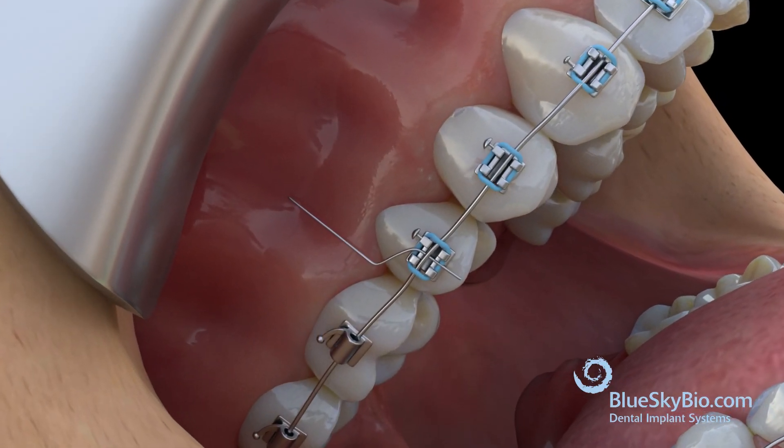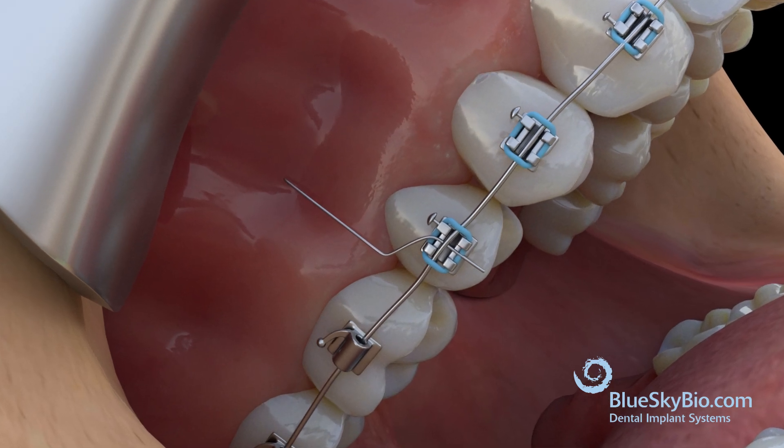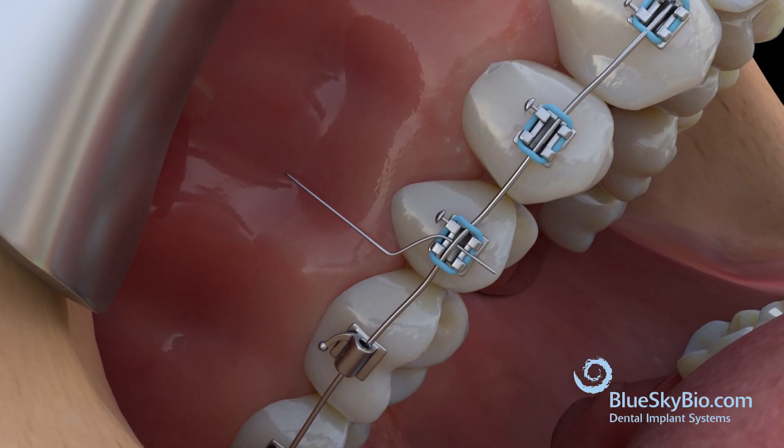Place a metal wire in the bracket that extends up between the tooth roots where it's used to mark the area for drilling and TAD placement.